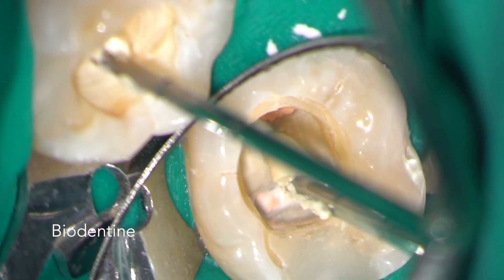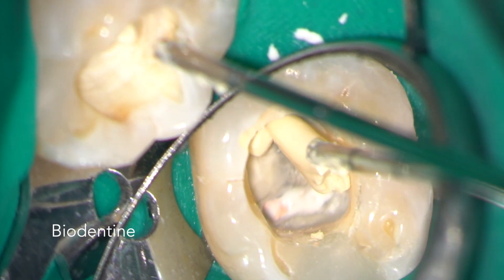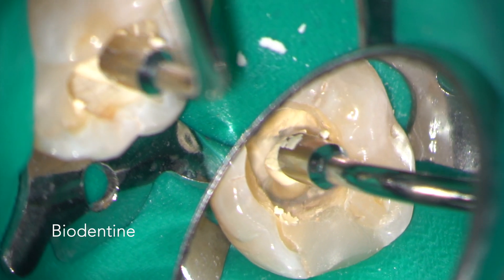Bioceramic materials like biodentine provide an excellent seal, and so when you've got a fairly minimal access cavity you can use the material as a restorative to seal the access cavity. In this case, I use biodentine packed across the pulp floor and then composite on the occlusal surface. I'm now packing biodentine across the pulp floor and into the access cavity.